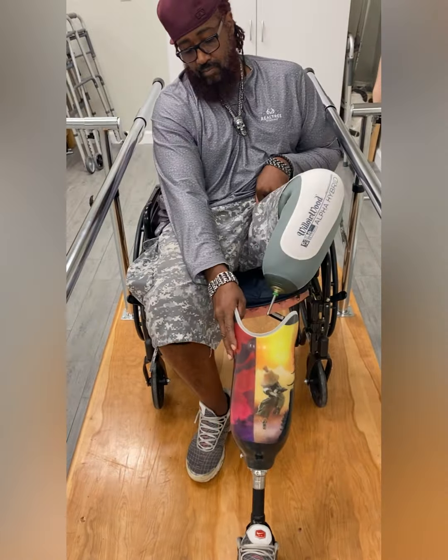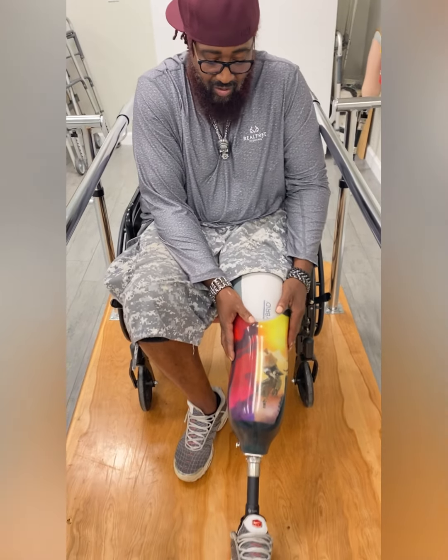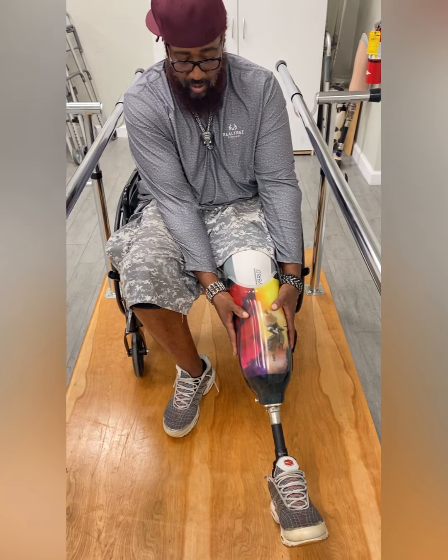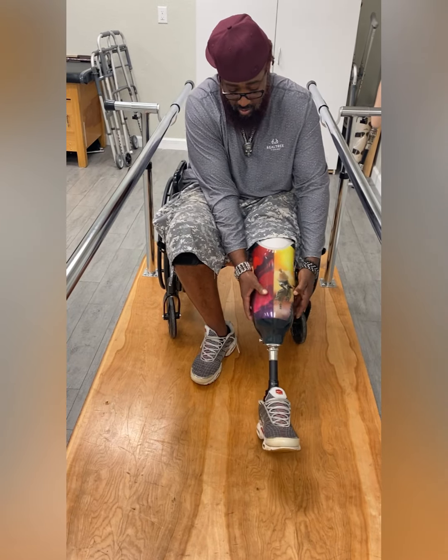Typically in the seated position, you will want to slide your limb into the prosthesis. You will want to hear at least one click before standing up. Feel free to use your hands to assist sliding into the prosthesis.